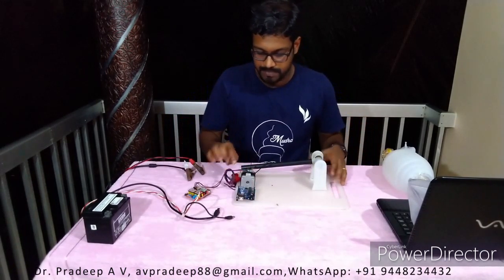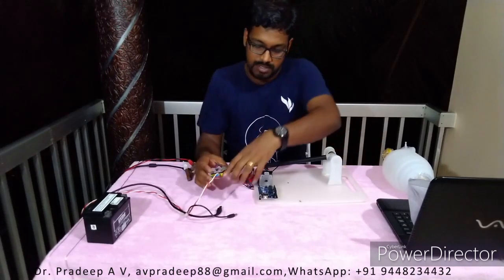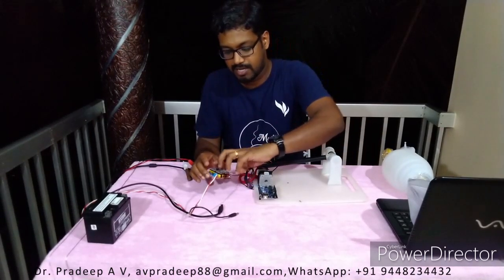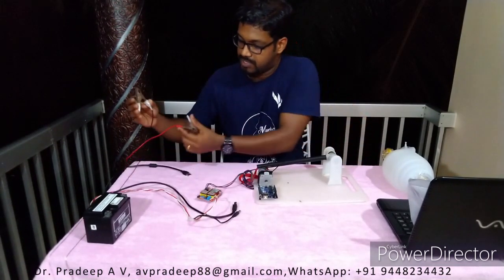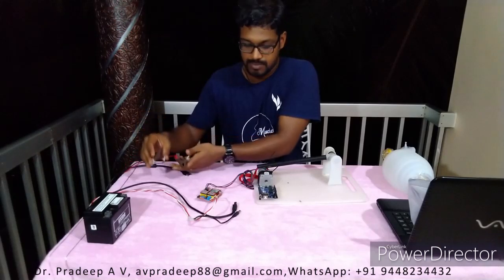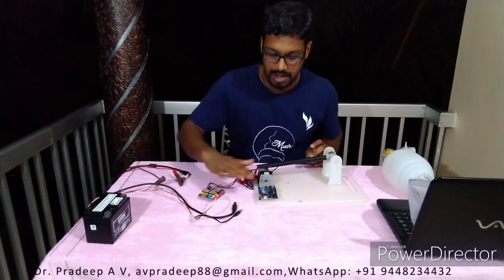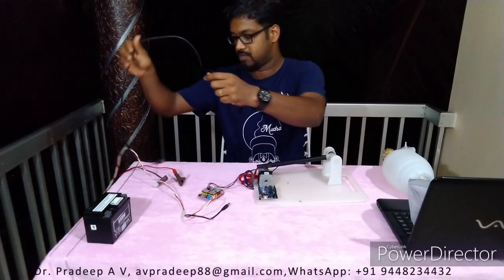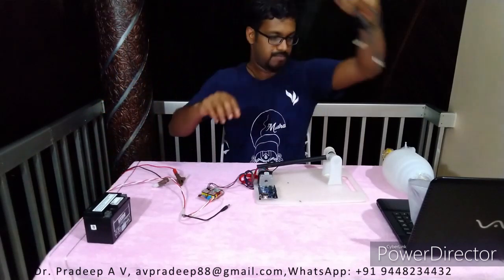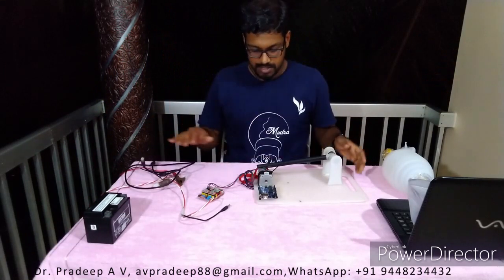So this is the Arduino UNO, and this is a NEMA 17 stepper motor. This is a V3 CNC shield, and these are the Pololu stepper motor controllers. So there's a wire coming from the battery, which basically powers this stepper motor controller and the Arduino through this wire. And we have another wire here. This is only used for programming from the computer to the Arduino. So the setup looked like this.